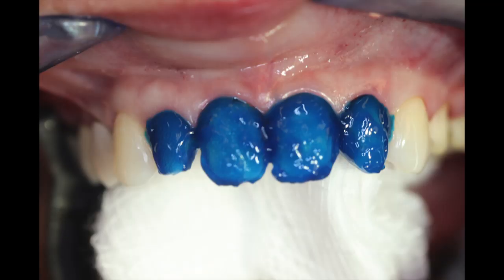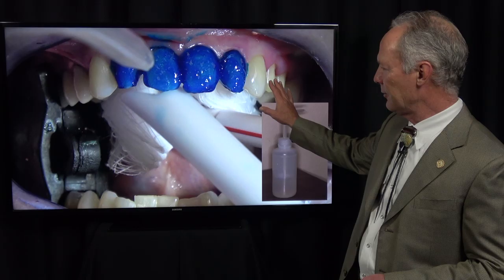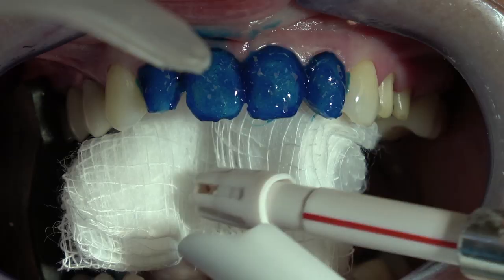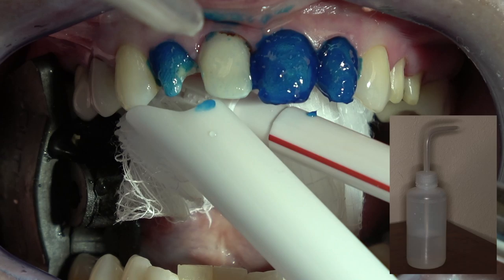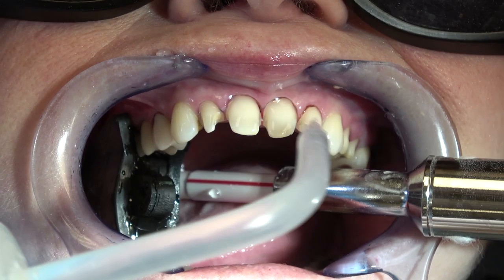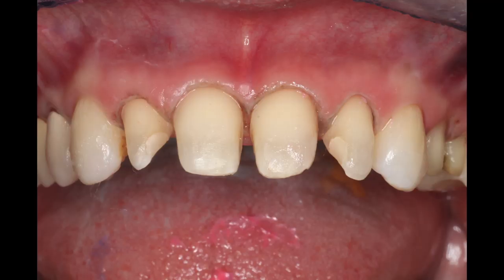I'll usually only etch 3 to 4 teeth at a time. If I had 10 teeth, I'd etch 3, then 3, then 4. So this is the ice cold water in the water bottle, and you can see the fantastic hemostasis. It causes any bleeding to scab.